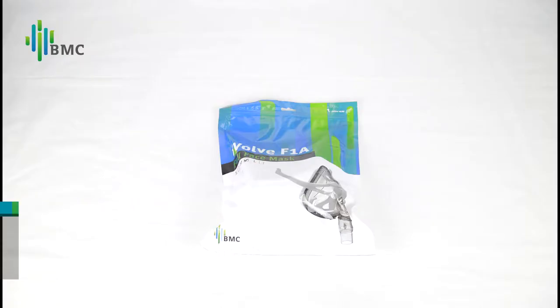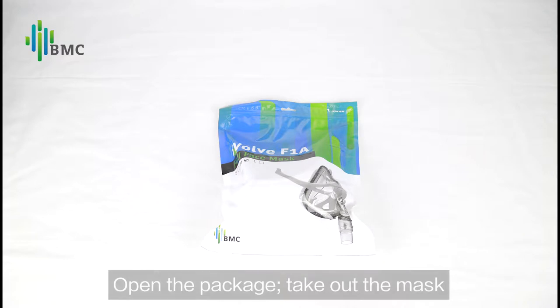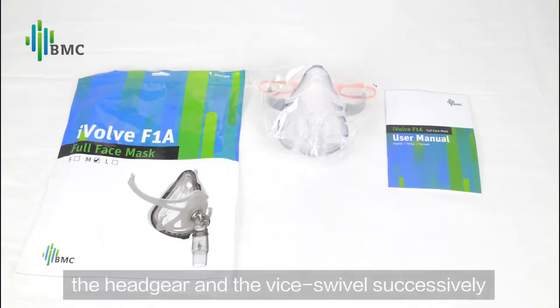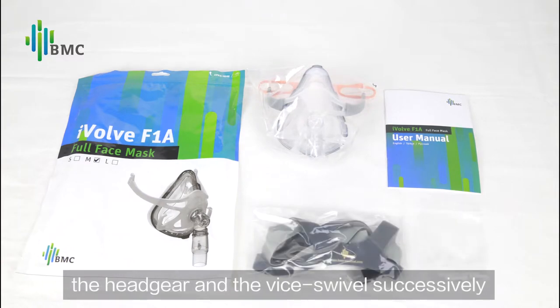Preparing the mask: open the package and take out the mask, the user manual, the headgear, and device swivel successively.